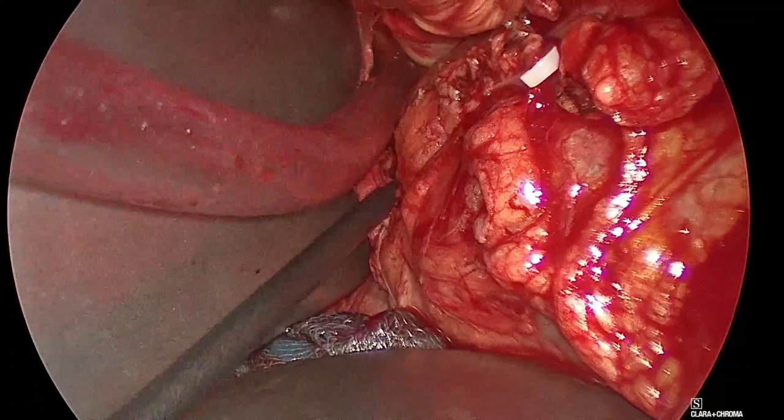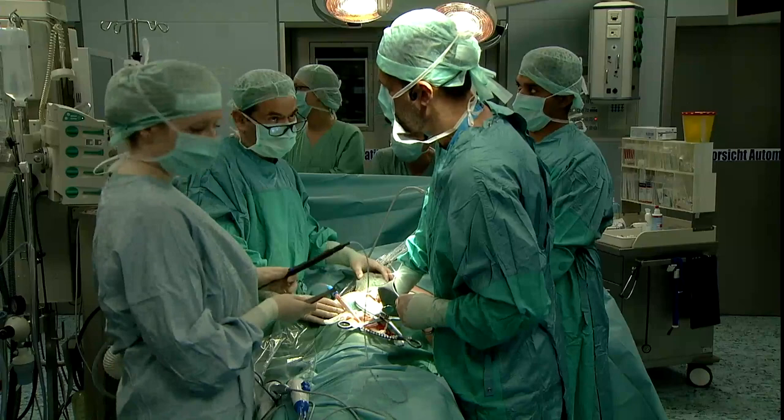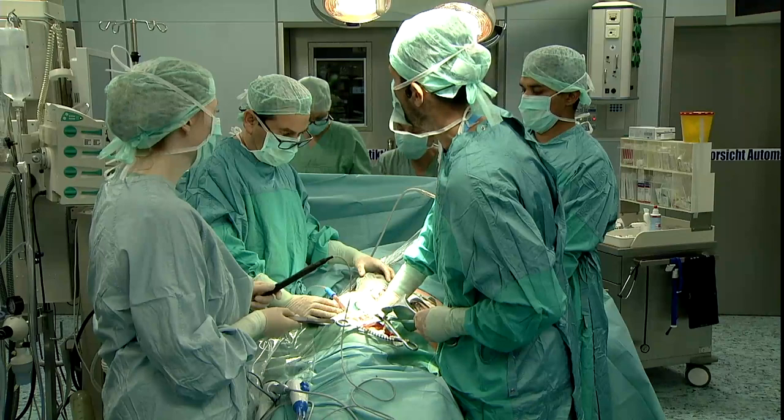Let me here hold this for a second. Just let me go in with my hand for a second. I want to feel where I am. Okay. So I have all the tumor in my hand. So the tumor was very low. So the answer to you guys before, where we were asking whether we should have or should have not clipped the ureter, I think is no, we should have not, because the tumor is very low. Right now I have my finger right inside the bladder, basically.